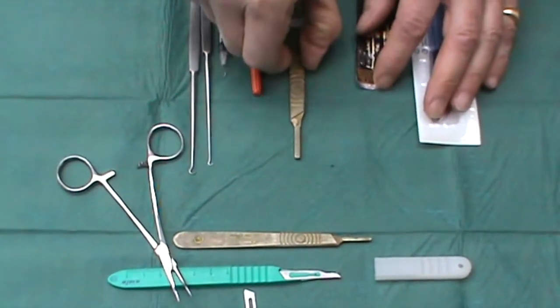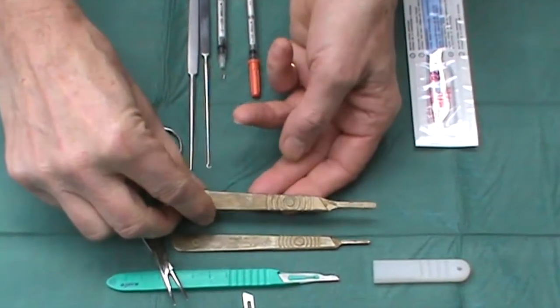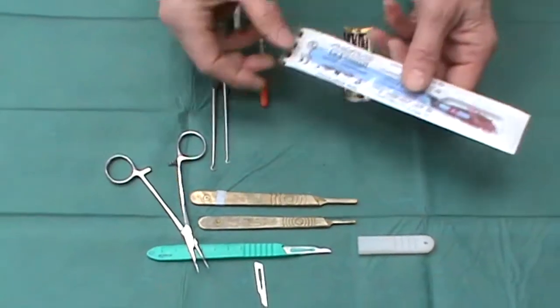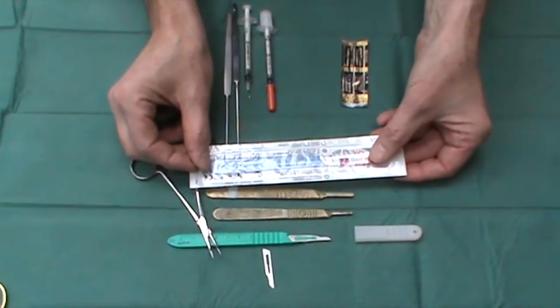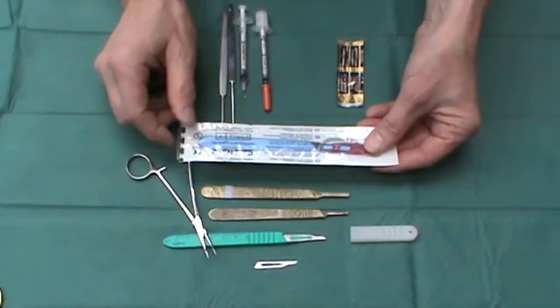If you have a larger number 20 or 22 sized blade, you need a larger handle. Those can also be in a disposable kit, but remember, disposable ones will be stainless steel, while the reusable ones will be carbon steel, so tend to be sharper.